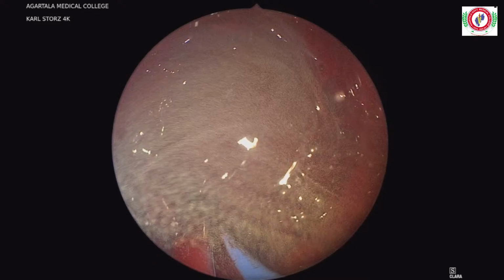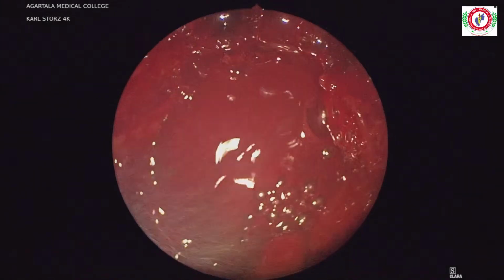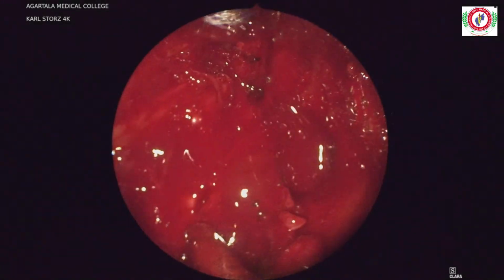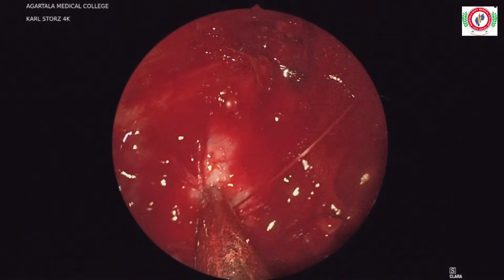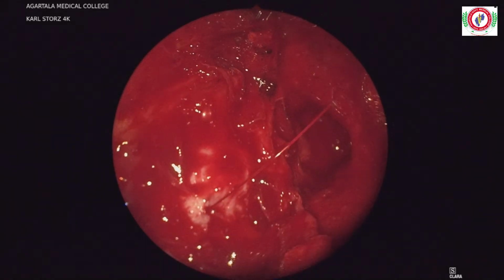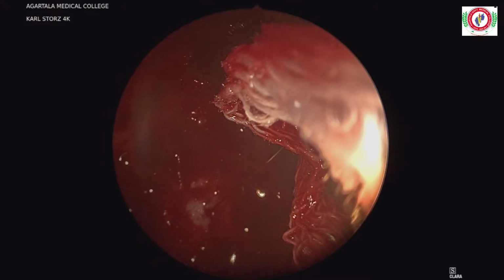So now I am sure that I have removed the tumor. This bleeding is not a problem for me. It will stop even with the packing only. Suction. I'll pack a little, then I'll do it. This bleeding makes sure that we have removed the tumor, because there is no vessel as such which arises from the posterior. This is all bone. There is no vessel which supplies the mucosa. So this was the main branch that was supplying the tumor. Give me pack.